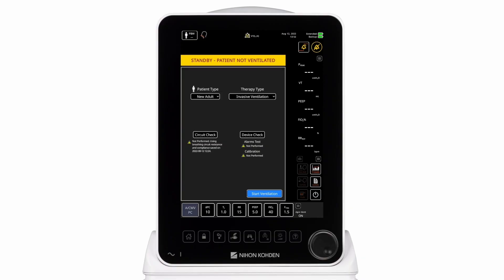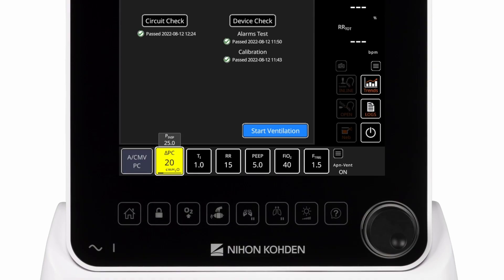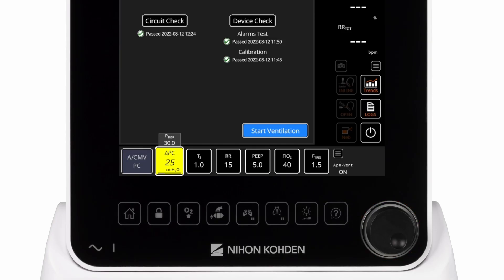When the ventilator is powered on, the startup screen will be displayed. On the startup screen, the clinician selects the patient type and the therapy type. Clinicians can also perform a circuit check or device check, with on-screen instructions guiding them step-by-step through the testing process. Clinicians can also set ventilation controls and alarm limits prior to starting ventilation. To adjust a ventilator control, the clinician selects the control to be changed, uses the encoder to adjust the setting, then presses the encoder to confirm the setting. When ready to begin ventilation, clinicians press the start ventilation button.